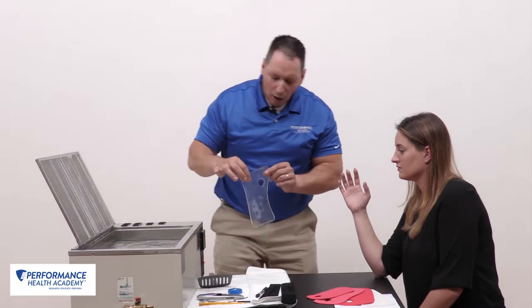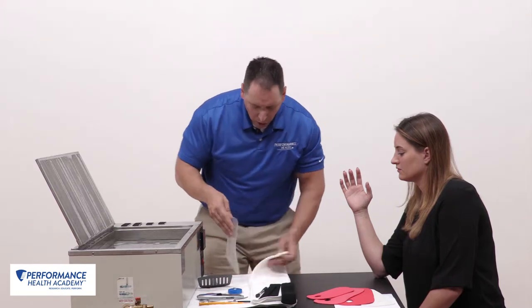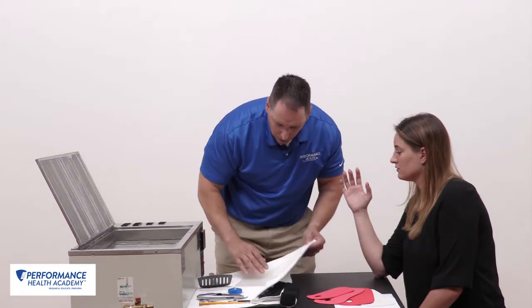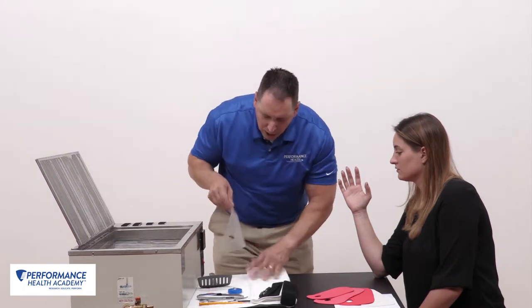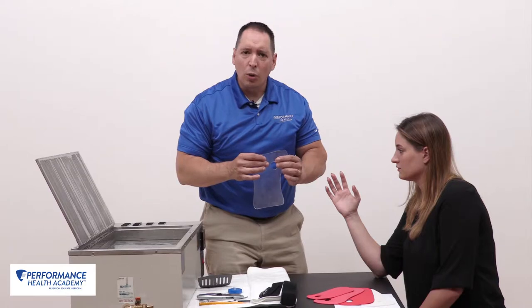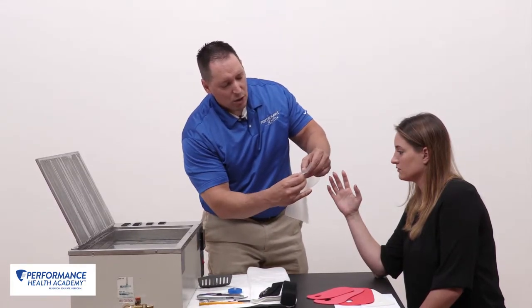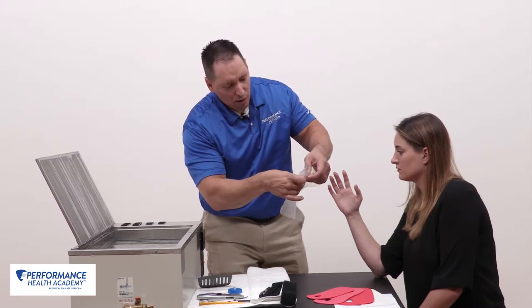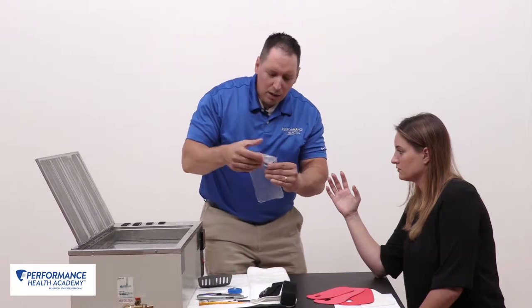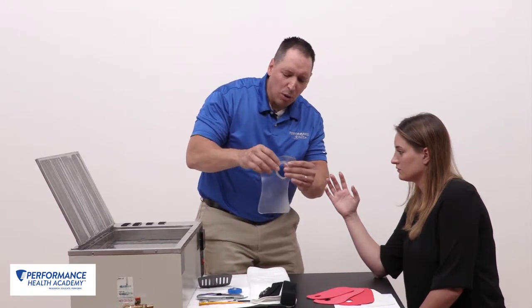We can see now this material that was opaque is now clear. I wipe the material off so it's not wet anymore. Be careful with aquaplast because it is very sticky — if its edges touch, it will stick together. I roll my thumb out here and want a nice edge, so I roll that out and the material is ready to apply to our patient.